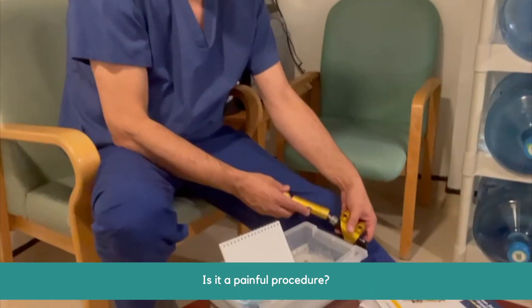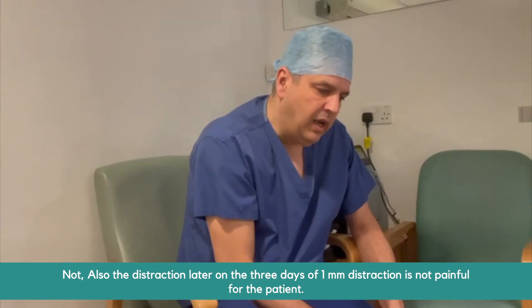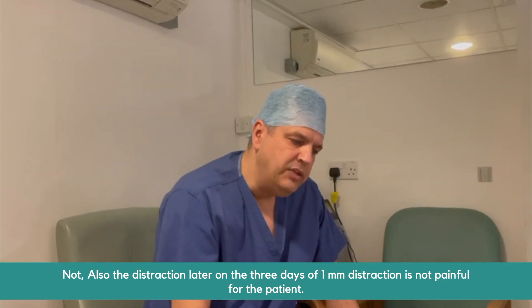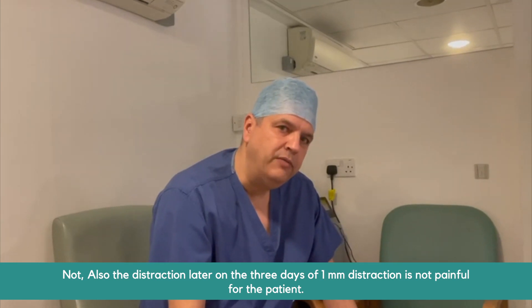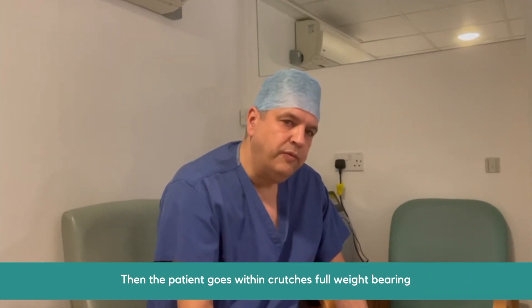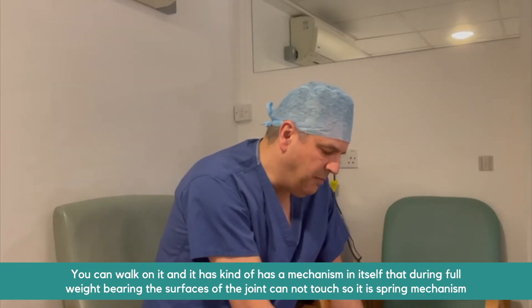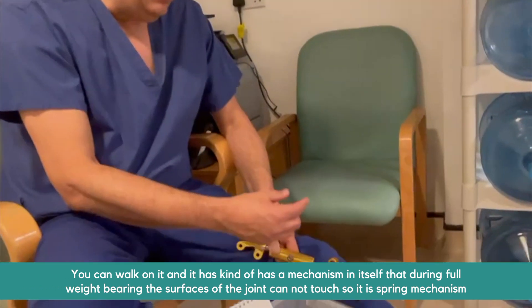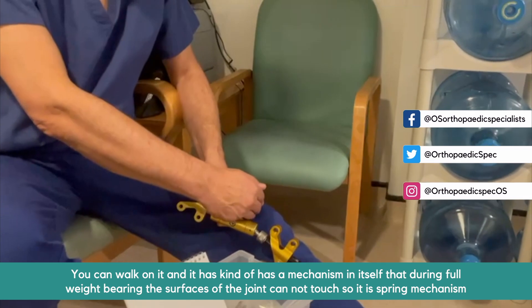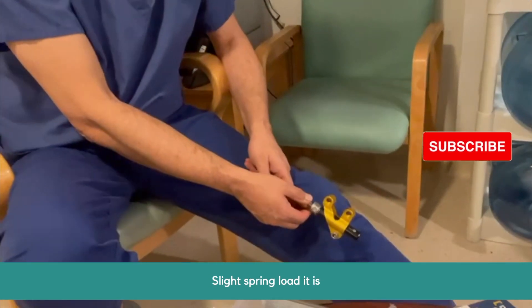Is it a painful procedure? Not at all. The distraction over those three days — one millimeter per day by the patient — is not painful. Then the patient goes on crutches with full weight bearing, so you can walk on it fully. It has a mechanism such that during full weight bearing, the surfaces of the joint cannot touch. It's a spring mechanism — slightly spring-loaded.